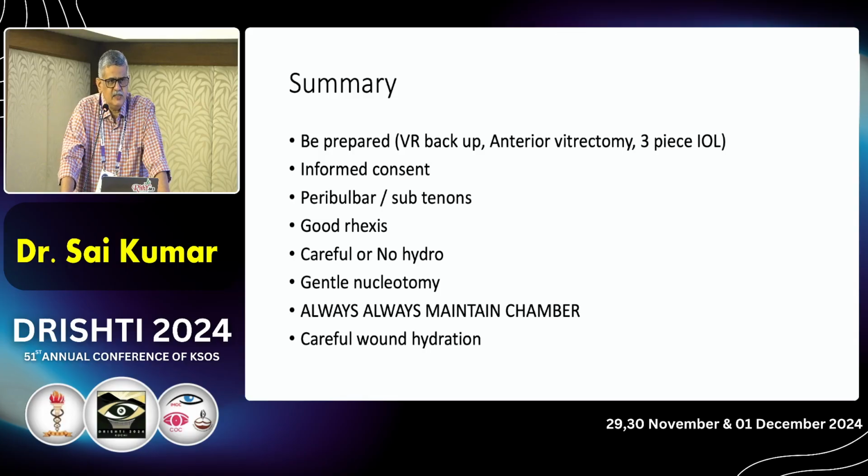A good rhexis is extremely important. Don't make the rhexis very large, don't make it very small; ideal for a sulcus fixation with a capture. Careful with the hydro, either no hydro technique or minimal hydro technique. A gentle nucleotomy. Don't pull the nucleus too much from this side or that side, because that maneuver or even that cracking maneuver can cause a PC rent.